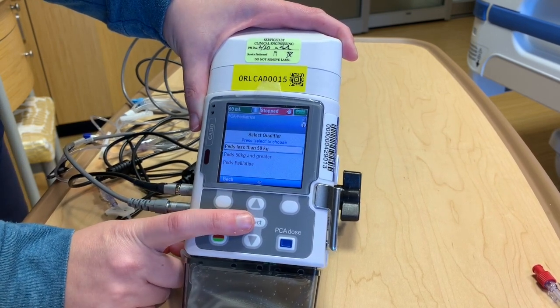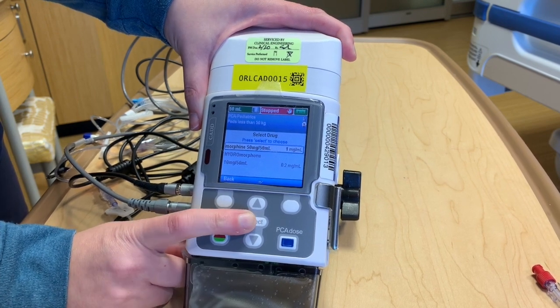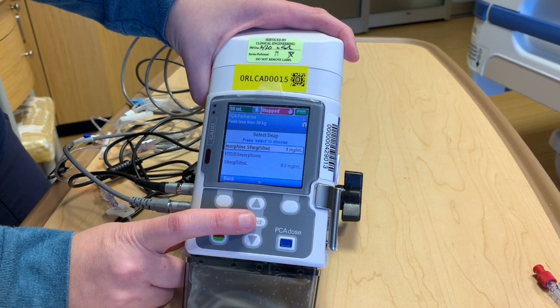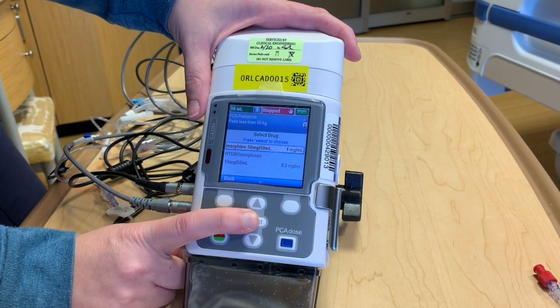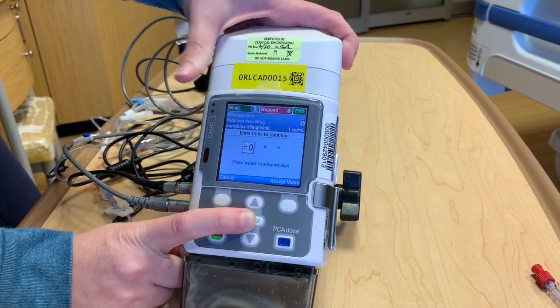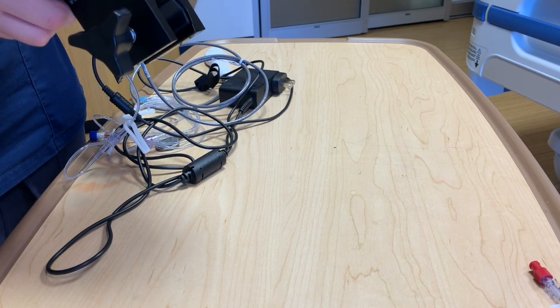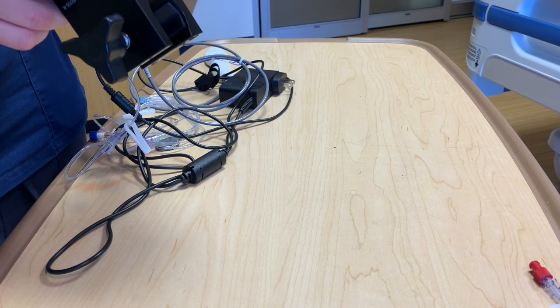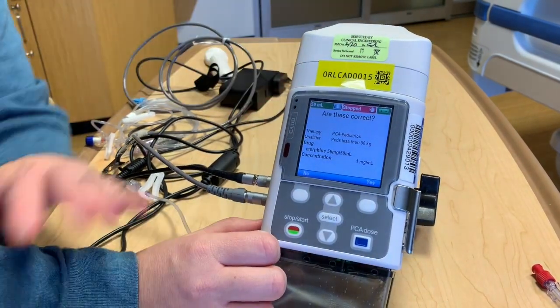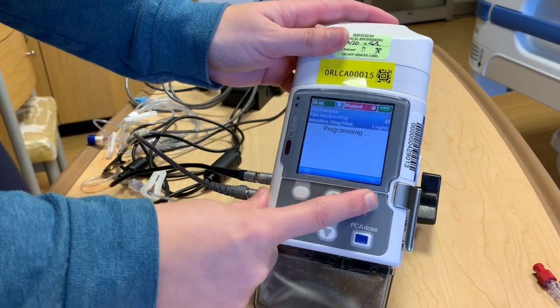Push select. It'll give you an option for less or greater than 50 kilos, so we'll say less for this example. It'll give you a couple of different drug profiles, so the one we'll select is morphine 50 milligrams to 50 ml. Then it's going to ask you to put in your institution's code, and it'll display everything you've selected so far and ask if that is correct, so we'll say yes.